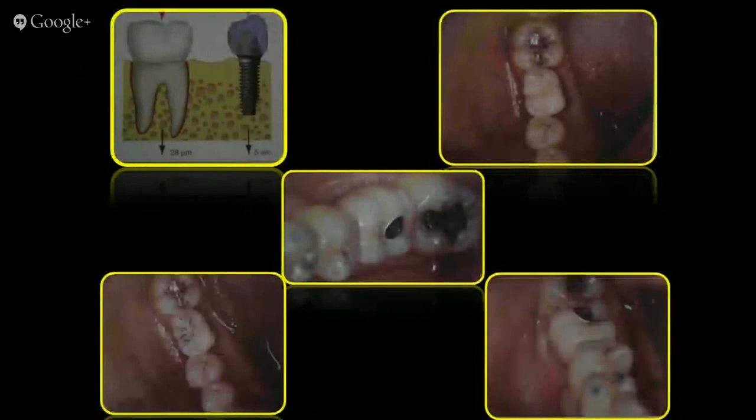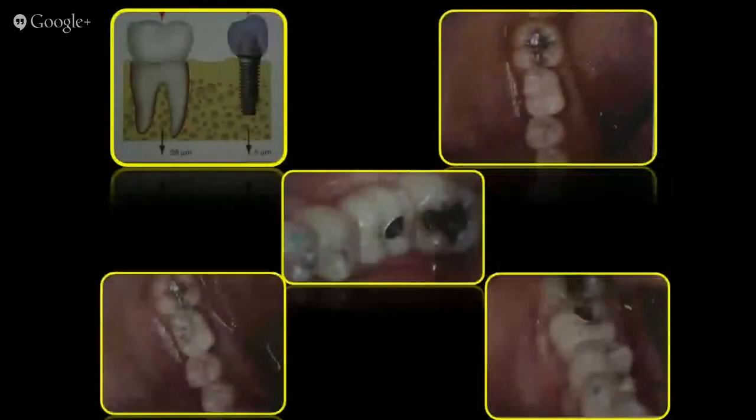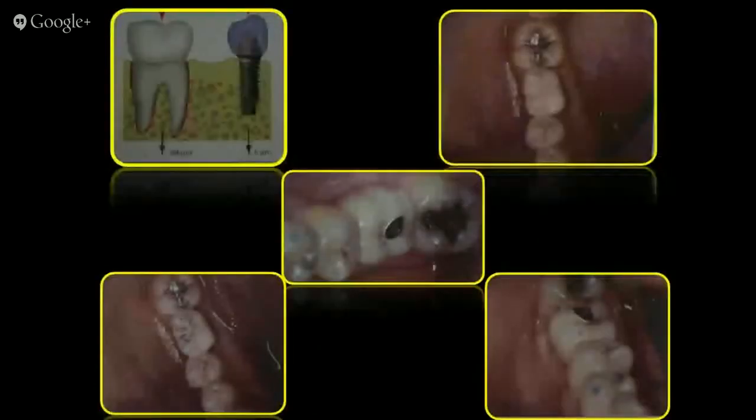How do I overcome this? Now that we know there is a problem, which we didn't know earlier, we would not have known how to avoid it. Now we've identified the problem, we should look for a solution. The solution is itself step one: timing of occlusal contacts.